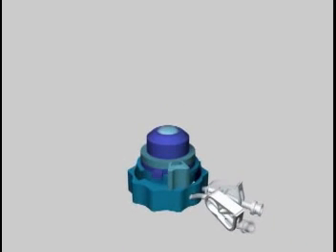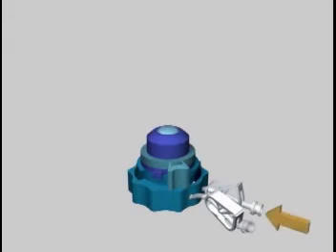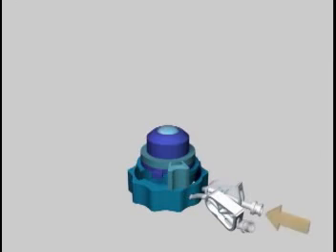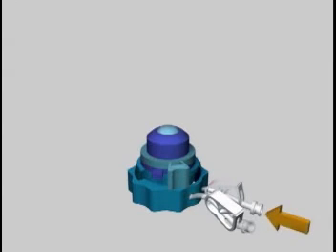Once the device is assembled, additional fluid can be injected into one of the silicone tubes using a Luer Lock syringe. This will increase the pressure within and deepen the anterior chamber.